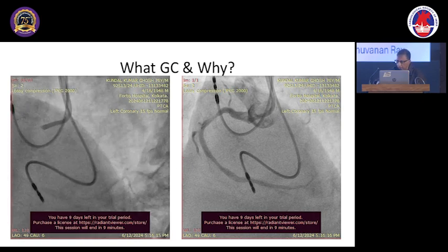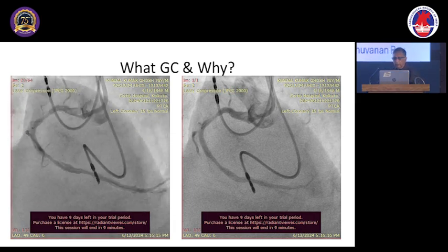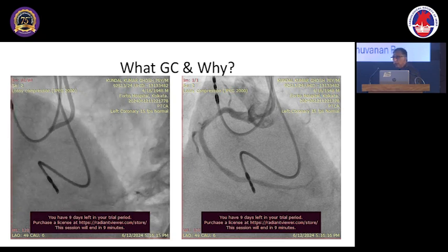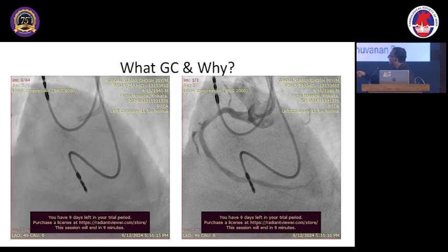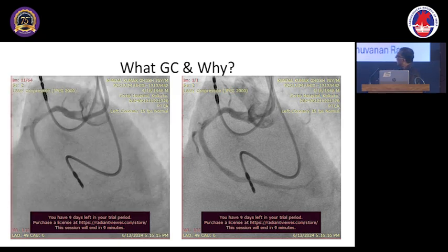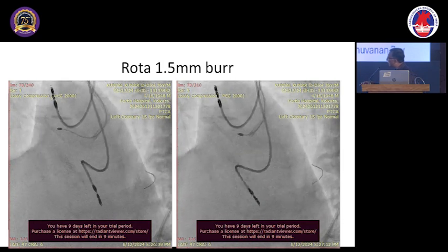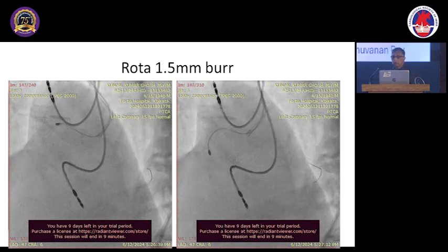The last, maybe, see this. This is an angiogram, and now this is a very important angiogram. What can you see? You can see that there is a very calcified lesion. You agree that there is a calcified lesion here? You can see the calcium there, okay? Now, if you look at the angiogram, you see that the artery has got two nasty bends. One is there to there, and then after that there is a lesion.